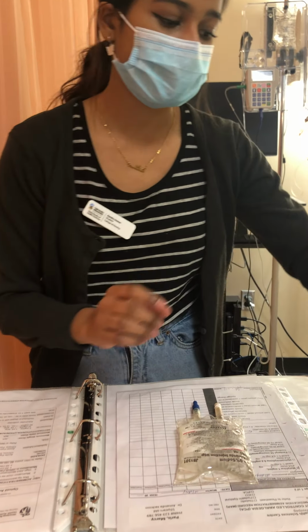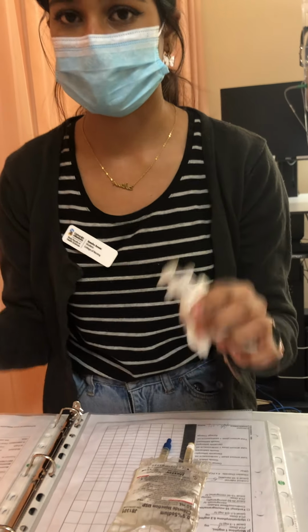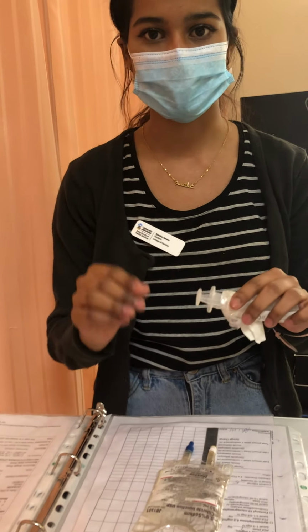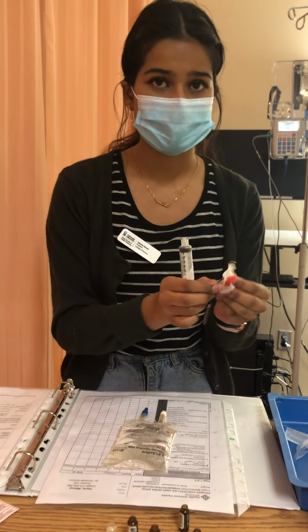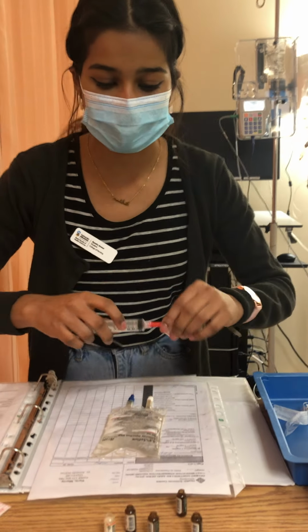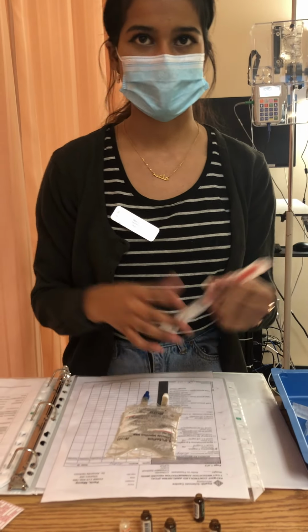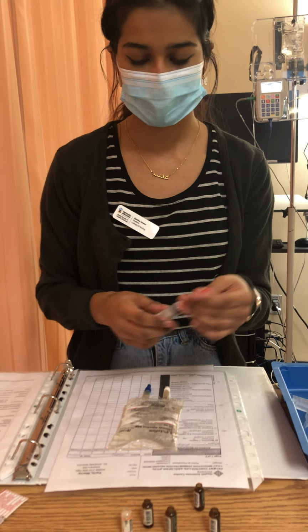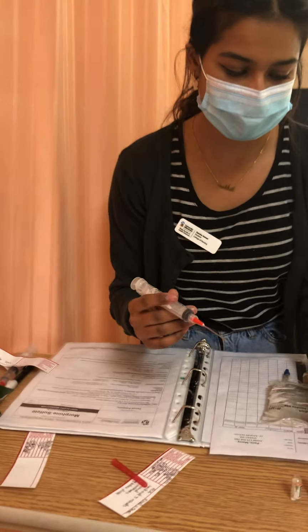Now I'm going to start pulling up my medication. So I'm going to get a 10 ml syringe for that. I like to use a 10 ml syringe instead of a 5 ml because I can see all the dose and I can maneuver it when I need to. So I'm going to aseptically attach a blunt fill needle. Normally I'd be using a filter needle for ampules, but since these ampules are already open, I don't need to use a filter needle, because they wouldn't be able to drop any of the medication. So I'm going to go ahead and do that aseptically.